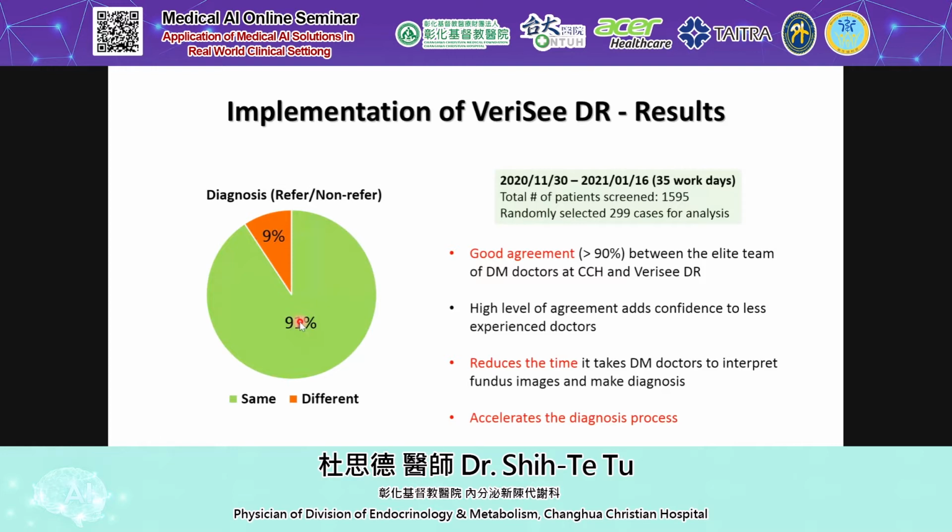And we can reduce the time it takes the DM doctor to interpret the fundus image. As I presented earlier, we just click the button and the report is produced in seconds. Then we just compare it with the photograph from the PACS, and decide whether to agree with the machine or make our own adjustment.